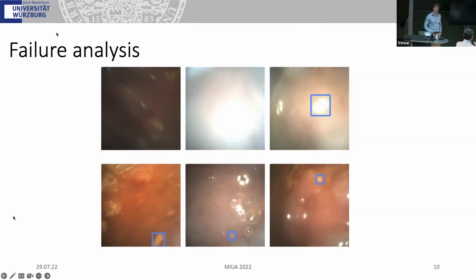Just a final comment. I don't know if you have considered changing the wavelength of the illumination, because if you go to infrared or others, you can see oxygenation and other things, and then you can say that's a bubble or that is a vessel or something different. Especially with big polyps, you would have vessels inside all the time. Yeah, I think that's very interesting too, and maybe we should incorporate it. The thing is that with real-time detection, you can't go with as much data as you can, because you have just a minimum amount of time to actually do the prediction.